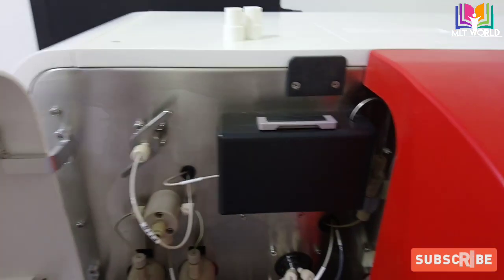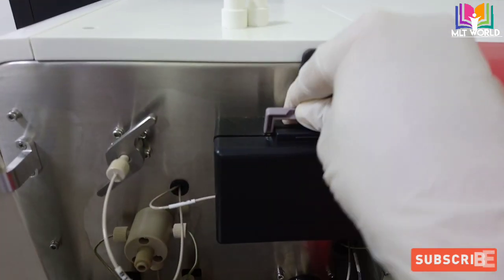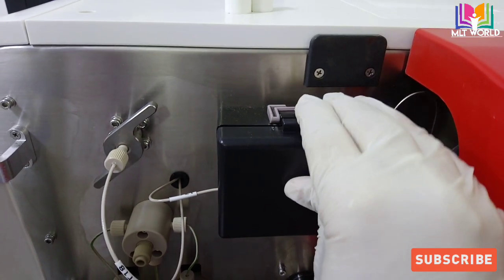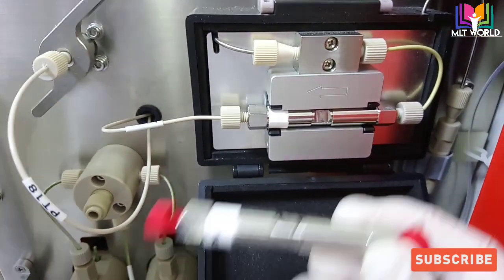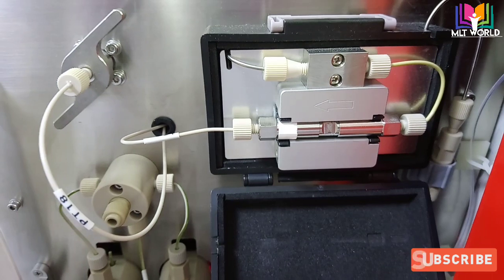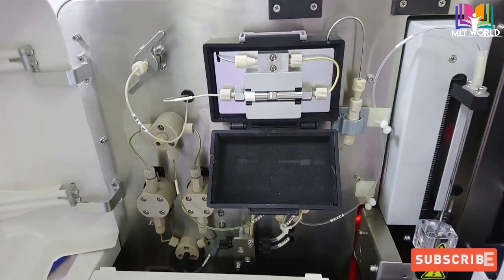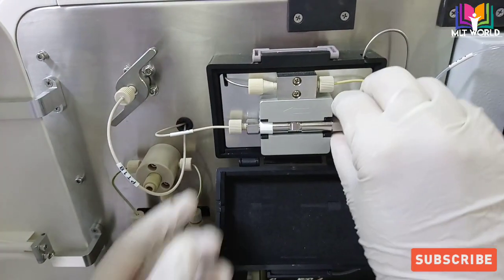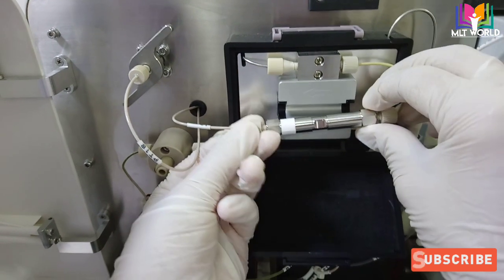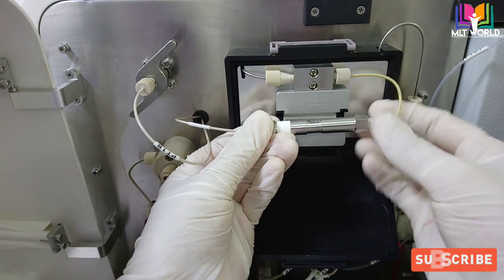Now we will move to the column. The box lock moves downward — you push it upward and it will open. We will open the knobs and focus on the arrow direction. You can see the arrow pointing to the left side. We will remove the cover so our hand moves easily and pull out the old column by opening the two knob screws.